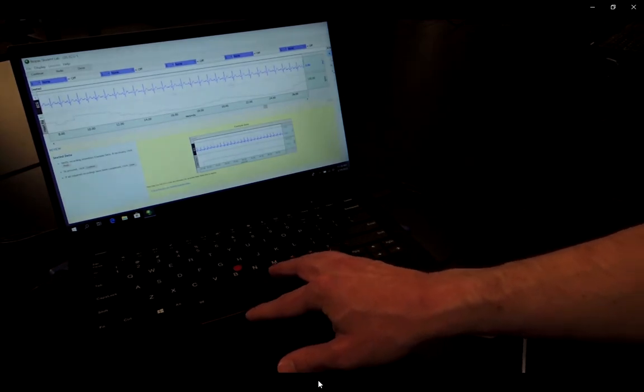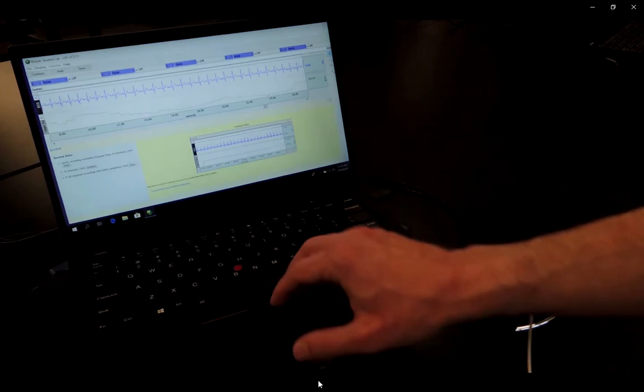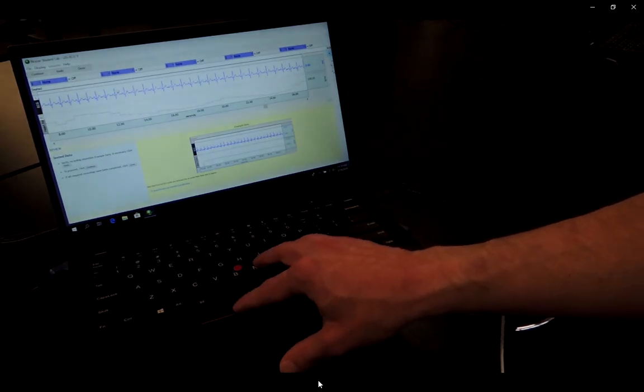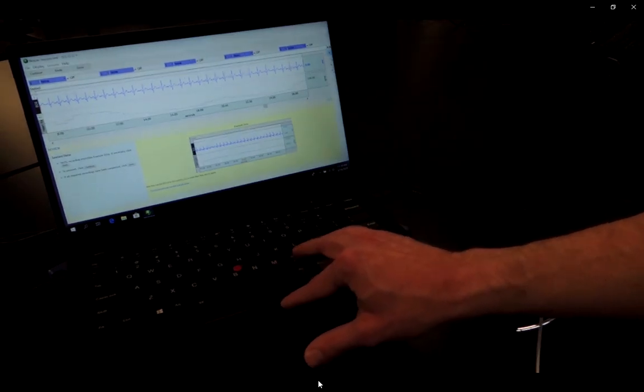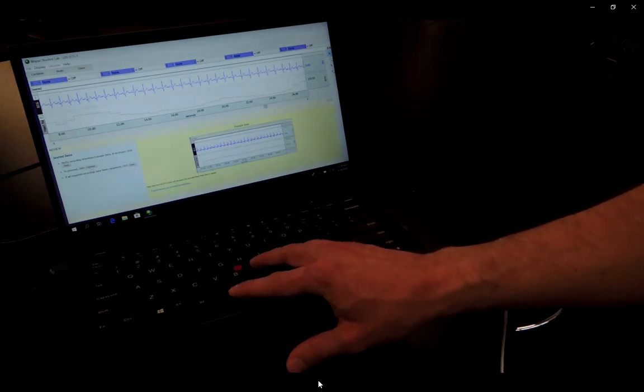That's the data right here that we're going to analyze as we start to see this flat part of the curve. That flat part of the curve of the example data is very clean, and we got an example of our data here looking pretty clean as well. So we've got some good data there. We'll go ahead and click continue.